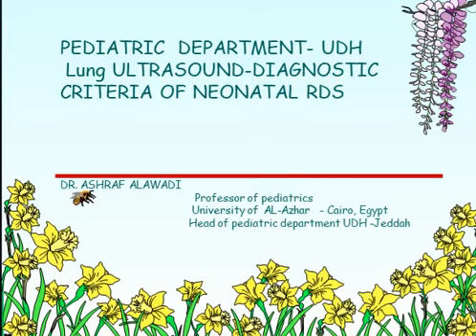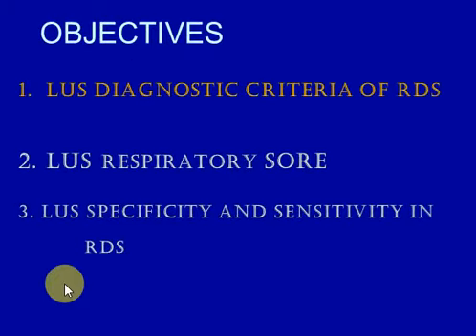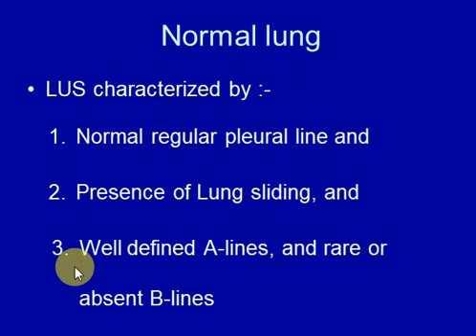Today we'll discuss the lung ultrasound diagnostic criteria of neonatal respiratory distress syndrome. Our objective today is to know the lung ultrasound criteria of RDS and to know about the lung ultrasound respiratory scoring system, with lung ultrasound specificity and sensitivity for diagnosis in RDS. We'll start with the normal lung.